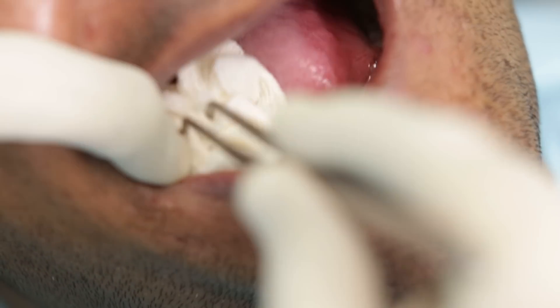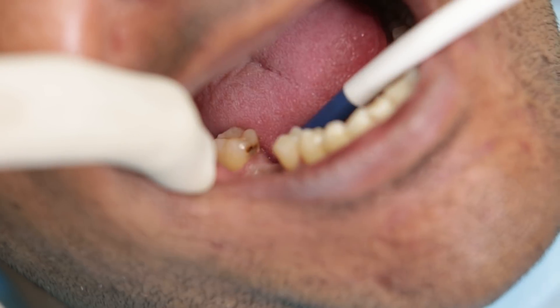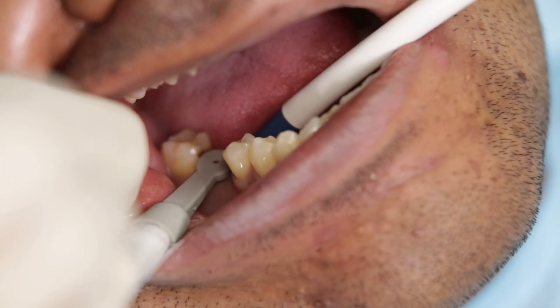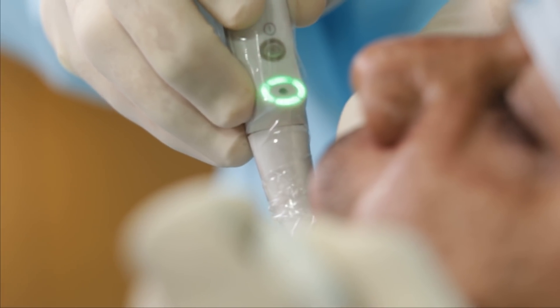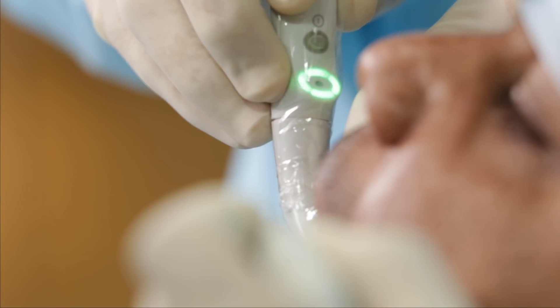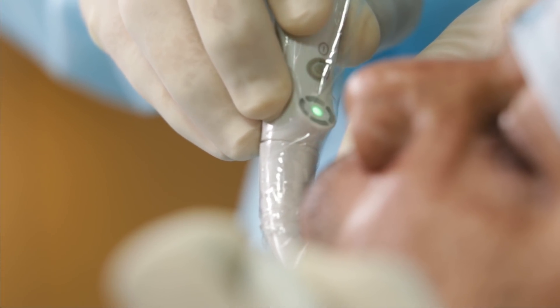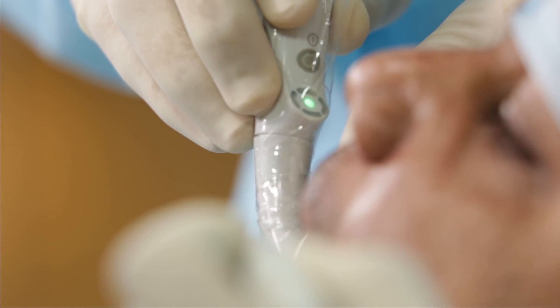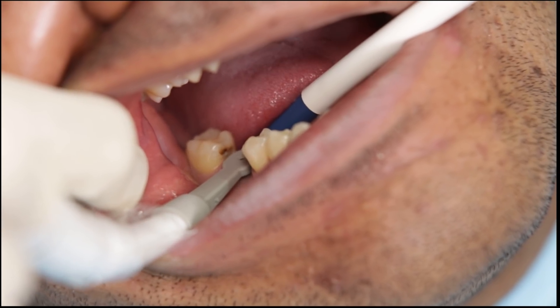It's also a good idea to mop the area with some gauze before we use the implant locator. I am now going to place the sensor along the crest at some estimated distance from the implant site and slowly move the sensor along the jaw. It's very important to have a smooth movement in the same direction until we get the green dot. I then repeat the same movement buccolingually.